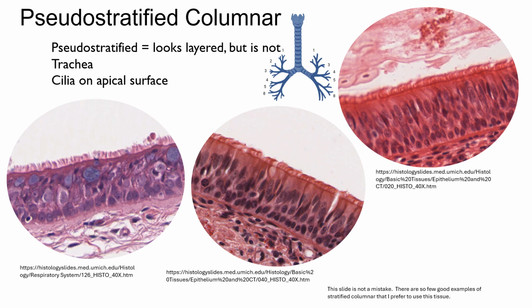This tissue really asks you to think of how these cells would look in a 3D presentation, right? Because here in a 2D slide, it's hard to visualize that. These column-shaped cells are not lined up in a row, right? They're not like that in simple columnar. They're all tangled together, like this wind chime that I have that has these strings of little bells hanging. I fight with it every summer.